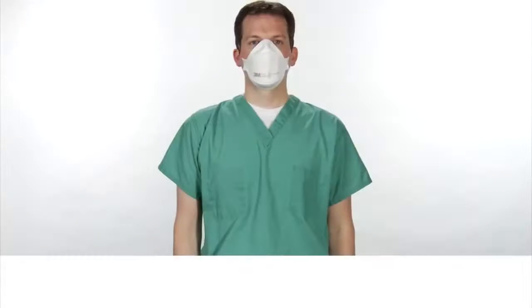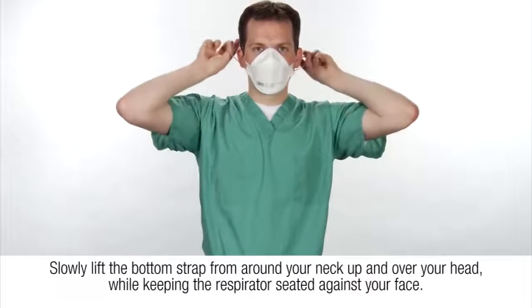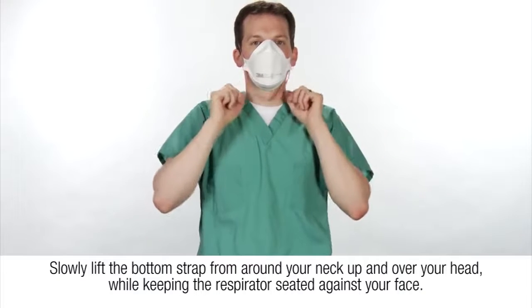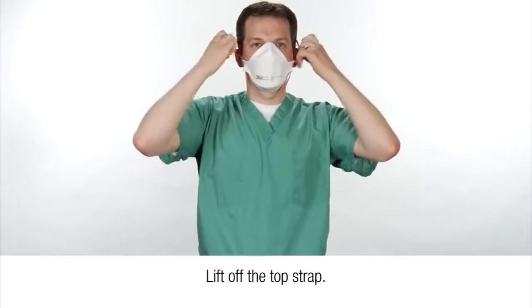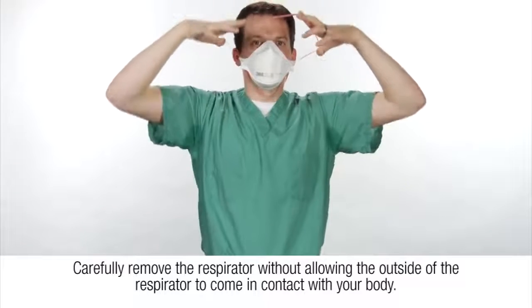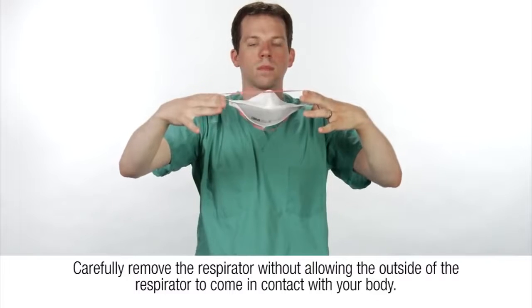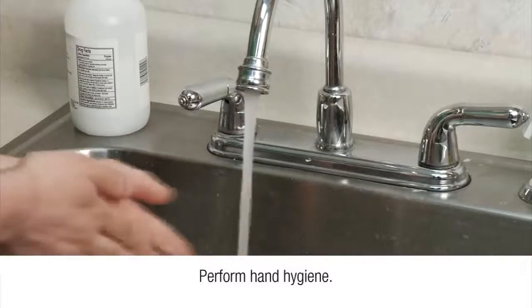To properly remove the respirator, do not touch the face piece. Slowly lift the bottom strap from around your neck up and over your head while keeping the respirator seated against your face. Lift off the top strap. Carefully remove the respirator without allowing the outside of the respirator to come in contact with your body. And perform hand hygiene.